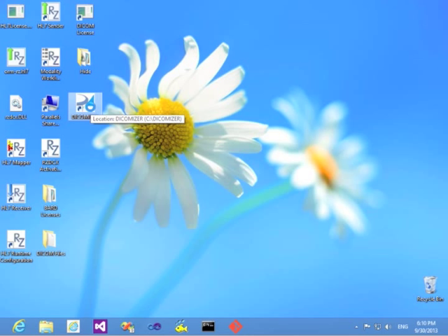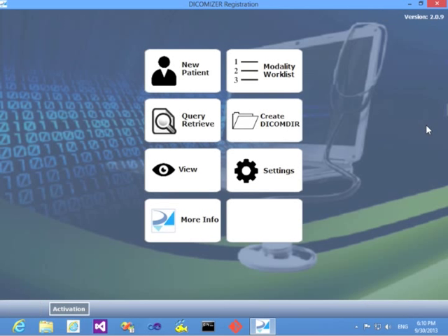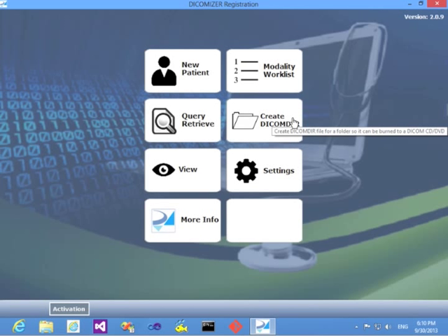Start the Dicomizer first, work in evaluation mode. Of course, you are encouraged to buy the product.